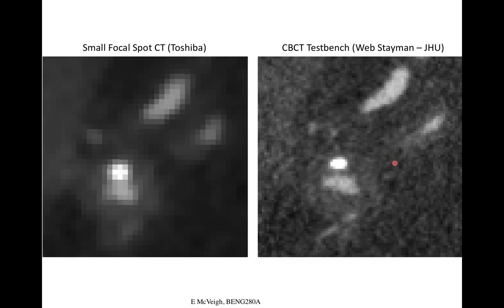Now, this data, you can see it is smoother, but it still has noise. It's just at a lower frequency, right? It's just like undulating waves as opposed to high-frequency waves. It's like in the surf, you have this primary surf wave, and then you have wind stuff, right? And then this is like the ripple, at high frequencies.